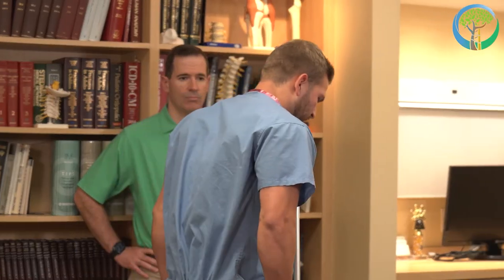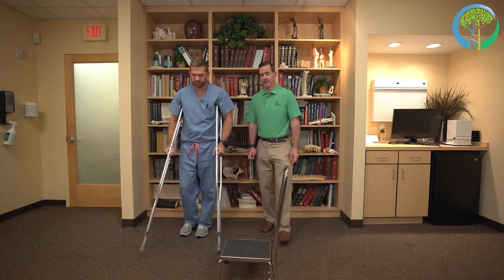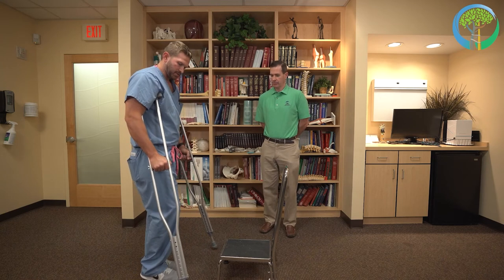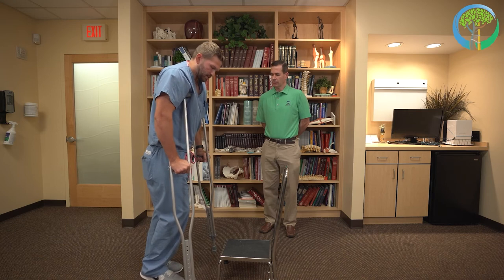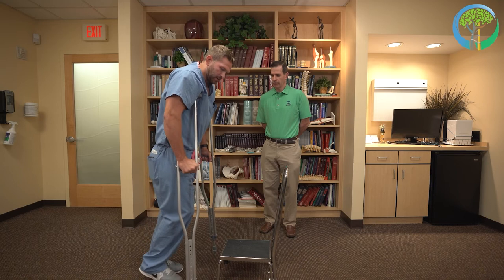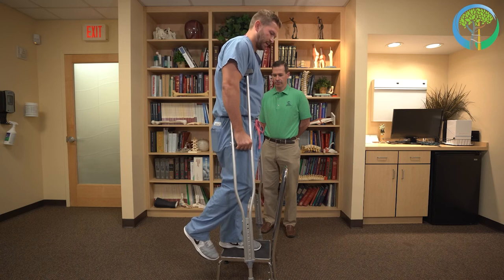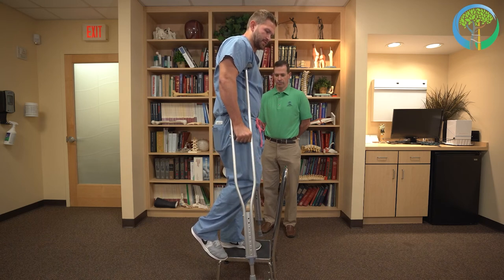He will now demonstrate how to use crutches when navigating stairs. Just like when taking a step, put the crutches slightly ahead of you, put your weight through your hands — not in your armpits — then push off the crutch with your uninjured leg and go up onto the step on your uninjured leg. Then repeat that step with the crutches brought up to the same level as you.